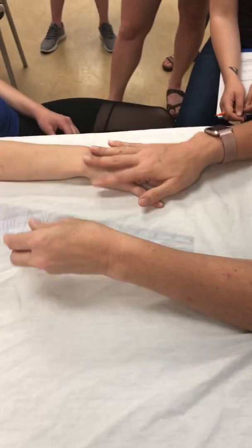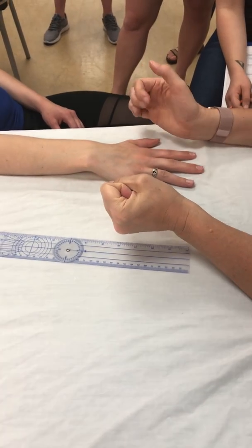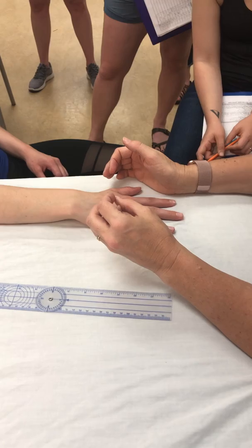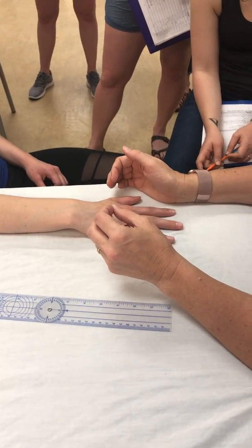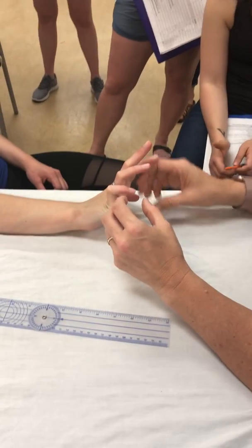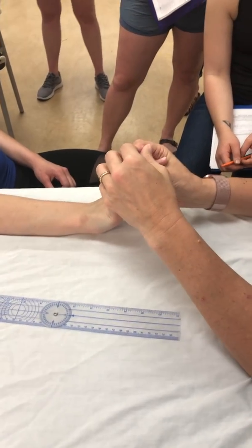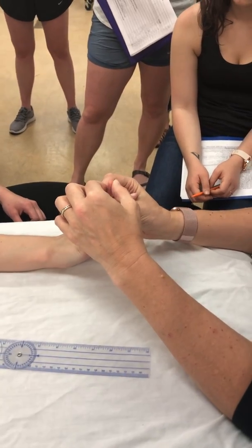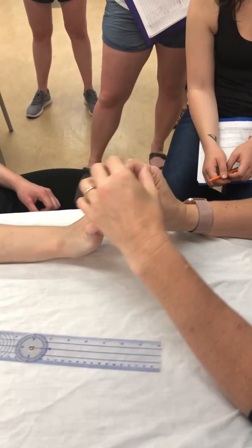All right. Were there any others that people had questions about? Or do you want to go practice those? DIP joint that it like extends some? Do you not worry about that at all? So, if you're doing passive, you would want to measure that. Okay. If you're measuring active, you probably aren't going to see that, and so you'd want to measure that as well.